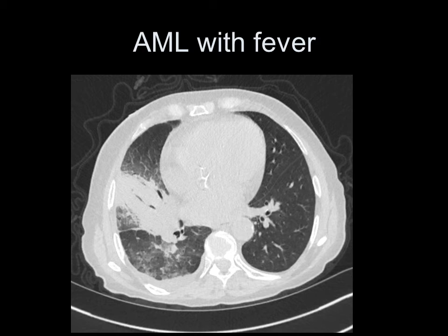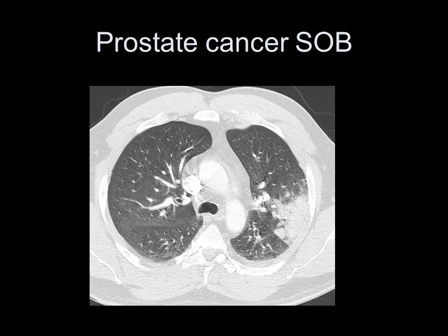Here's what I would consider a much more severe area of consolidation, and I think I'd be fairly confident about this because the patient did have a fever, significant respiratory symptoms, and improved with antibiotics. We have a large area of opacification with air bronchograms that are well separated. The clinical history here is acute myeloid leukemia with fever.